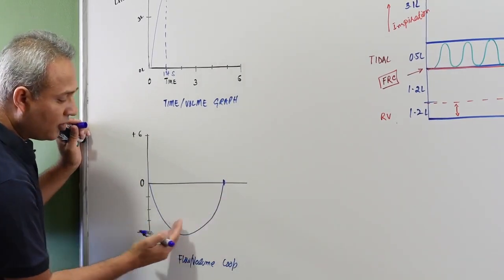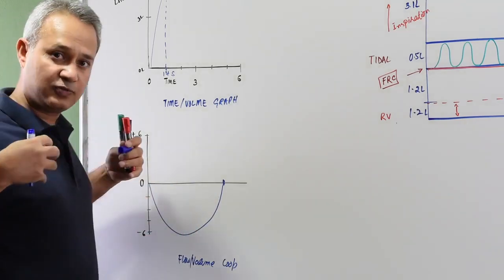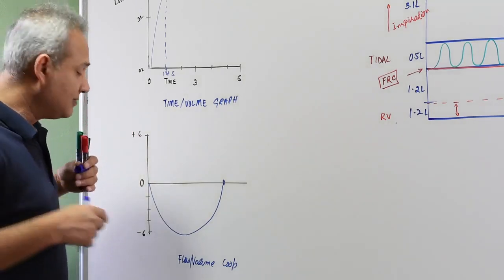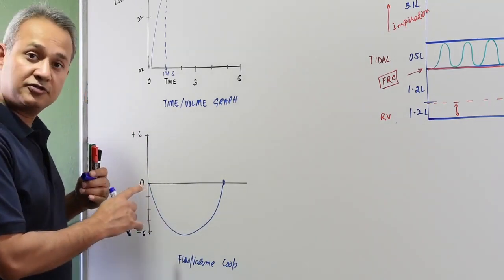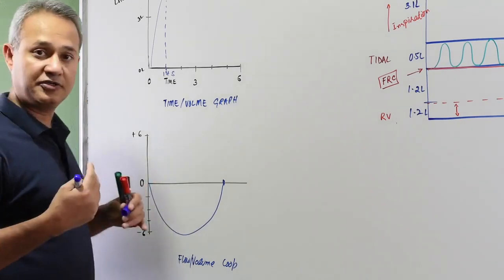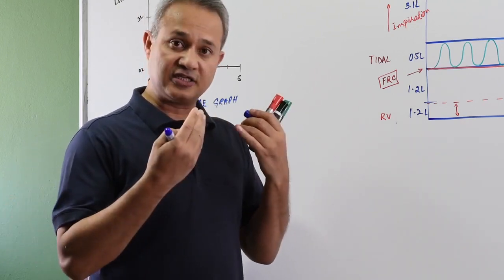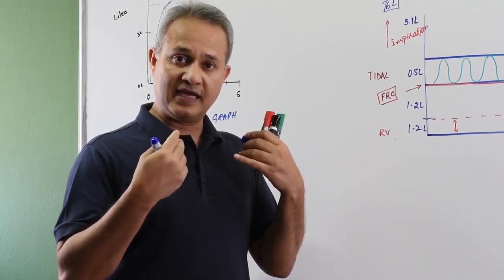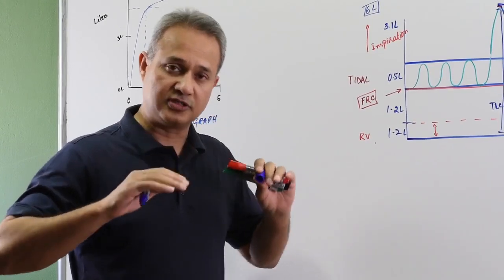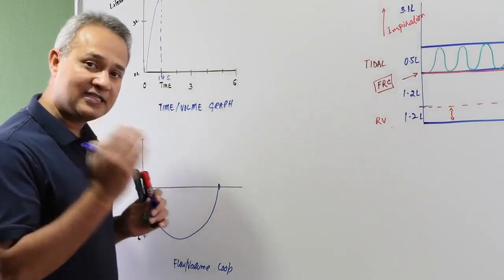So there is sort of a uniform increase in flow of the air going in and the volume expansion of the lungs, and then as the volume keeps expanding and reaches its maximum, further flow starts reducing. So now the chest is at its maximum volume, but the flow has reduced. So flow slowly starts increasing, inward flow, and then at the end of the inspiration, it slowly stops increasing, so it reduces. So that is it. Now, when you do exhalation, that's very interesting.